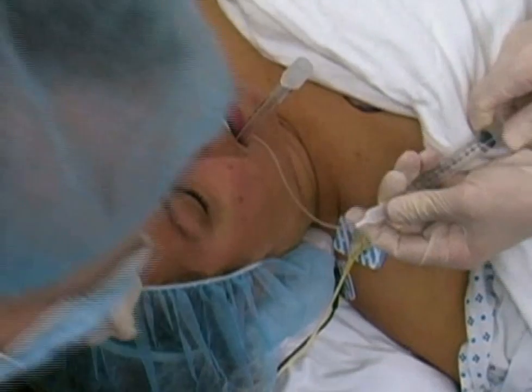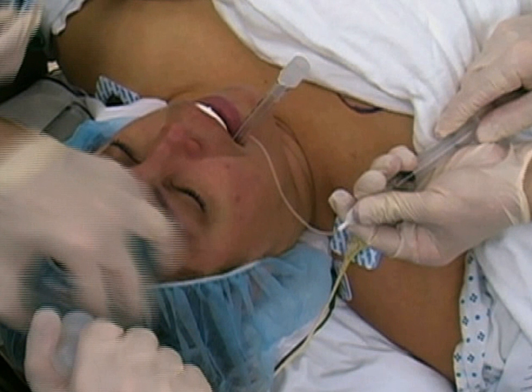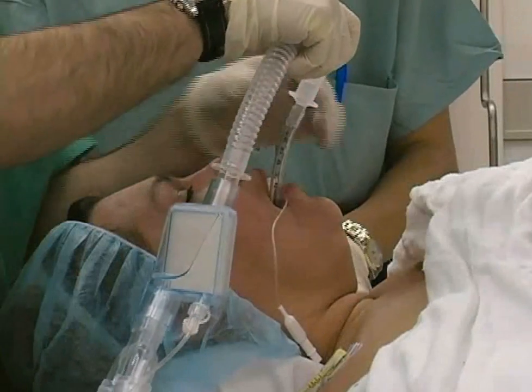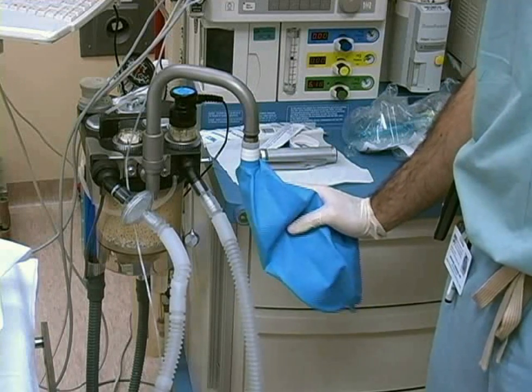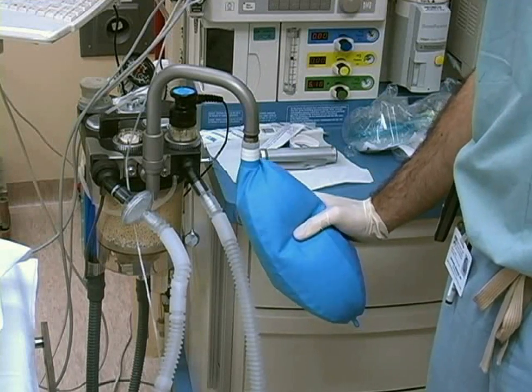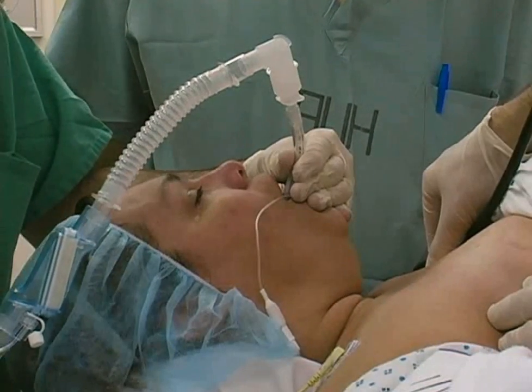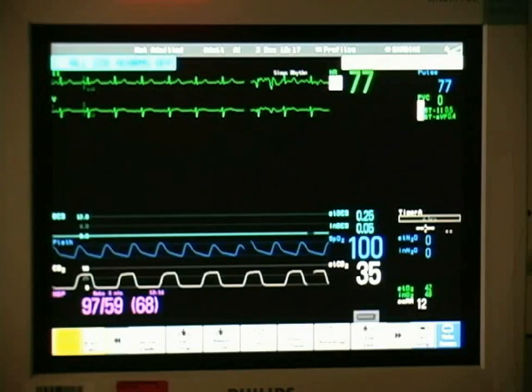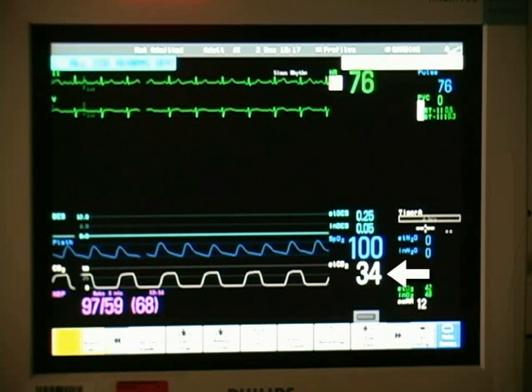Carefully remove the blade, inflate the cuff of the endotracheal tube with a clean syringe using the minimum volume of air needed to prevent a leak. Connect the endotracheal tube to the breathing circuit. Provide a gentle breath with the reservoir bag, not to exceed 25 centimeters of water pressure. Confirm successful ventilation by watching for chest rise and auscultating the lungs bilaterally. Verify ventilation by checking the monitor for the presence of end-tidal carbon dioxide.